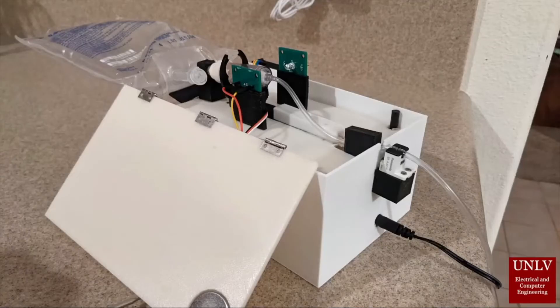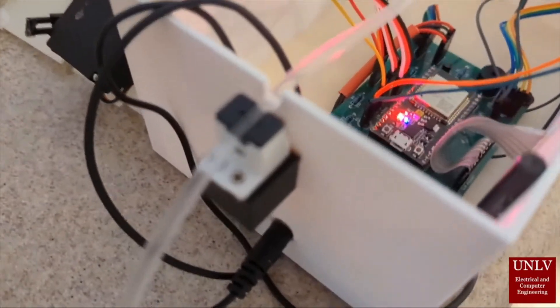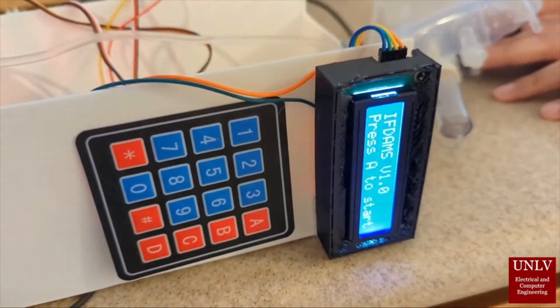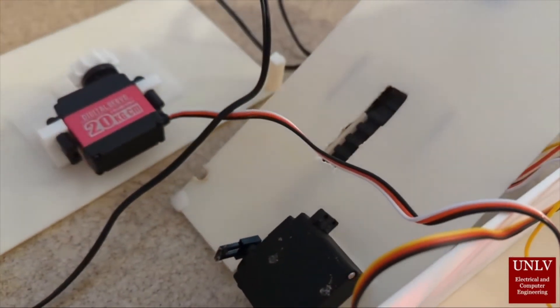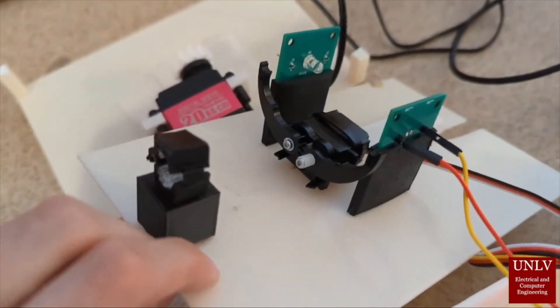This is the basic overview of the IFDAMS device. The top layer is mostly focused on the sensors that we will talk about later. We have three different layers to our device: the PCB on the bottom layer, our air bubble detector, and on the outside we have an LCD and keypad. There are also the gear railings and the gear up to the left.